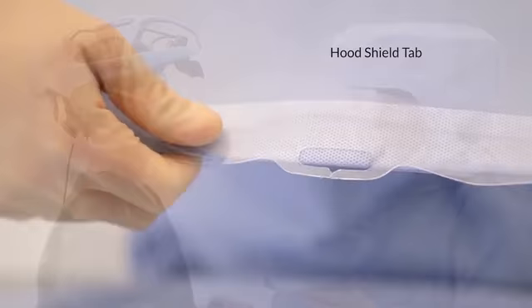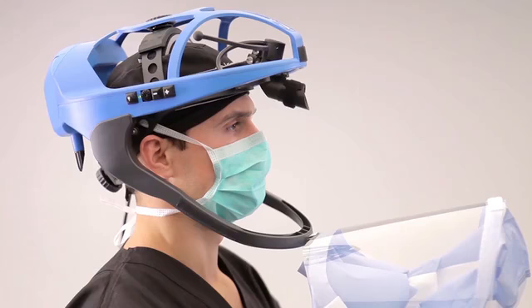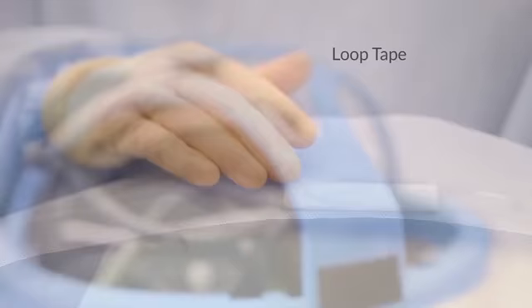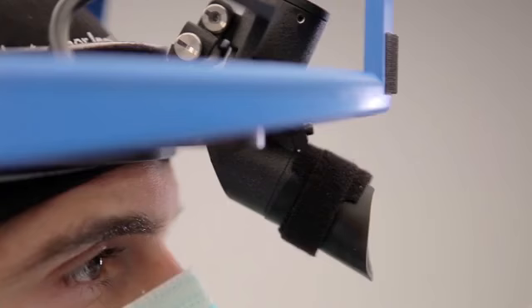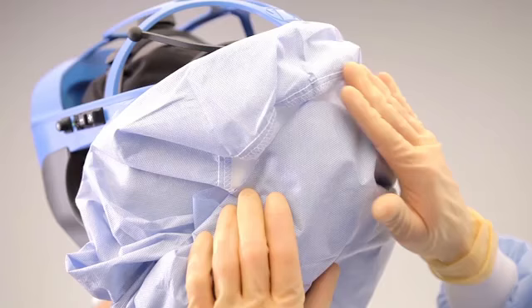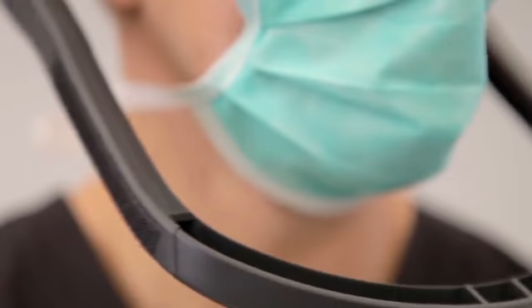For the assisted donning of the system, grasp the hood on either side of the shield and hook the tab into the slot on the helmet chin bar. Notice the loop tape that is located on the top of the hood shield. Position the loop tape against the central portion of the helmet so that it adheres to the hook tape located within the front of the helmet. Curve the hood shield around and firmly press the hook and loop tape located on each side of the hood shield to the mating hook and loop tape on the respective sides of the helmet chin bar.